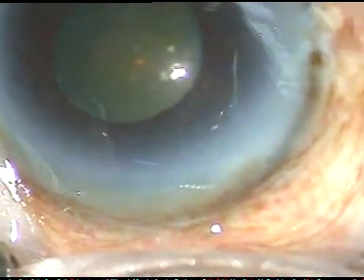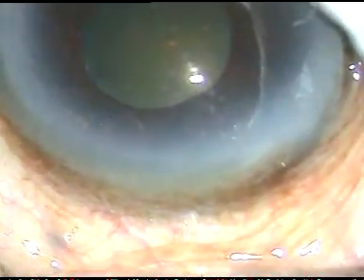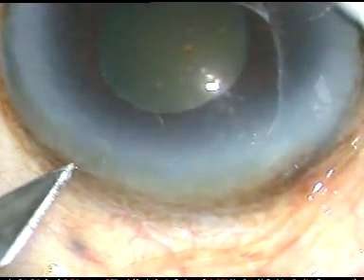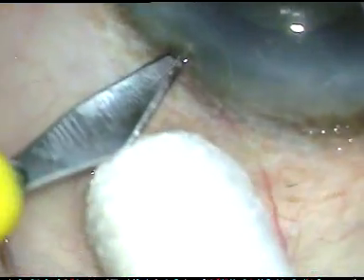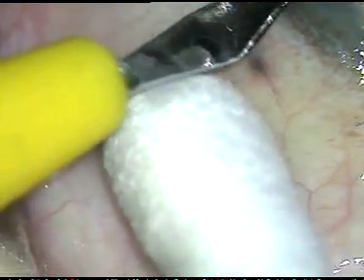By this time I have made the main incision and here is the side port. The main incision is at around 11 o'clock and this side port is at around 2 o'clock.